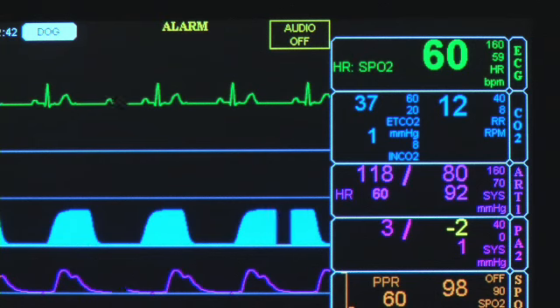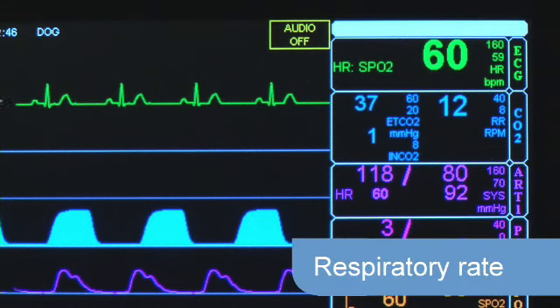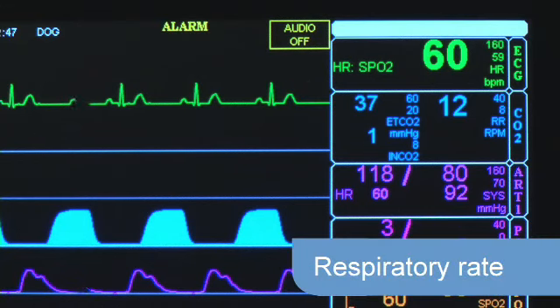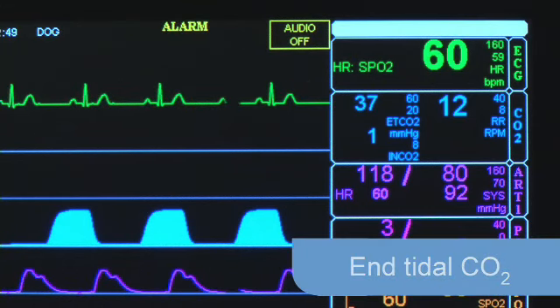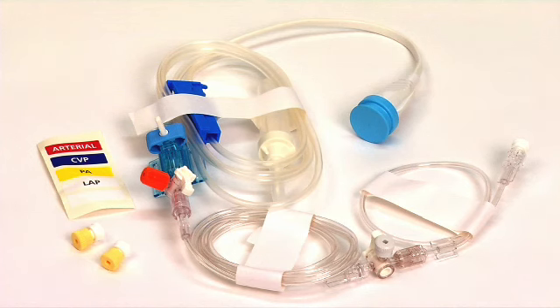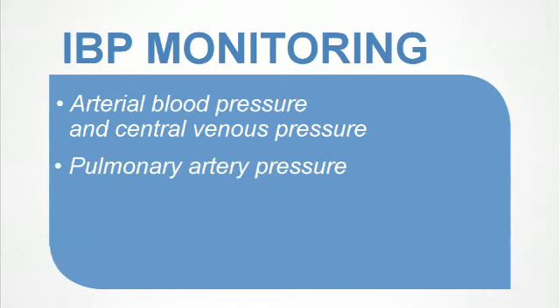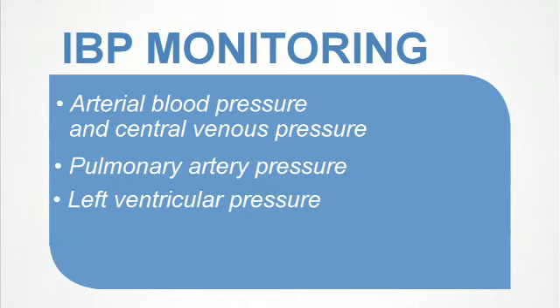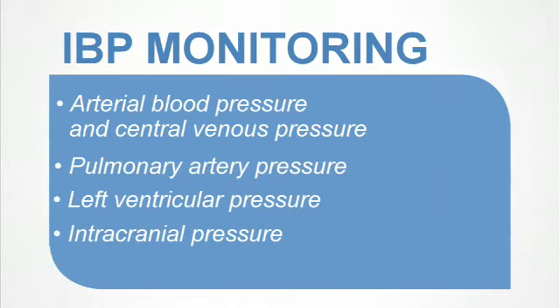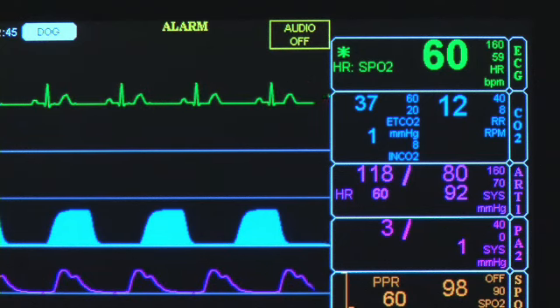You can also observe the capnography waveform on the display and monitor the respiratory rate, end-tidal CO2, and inspired CO2. Optional invasive blood pressure monitoring includes two invasive pressure channels for measuring direct arterial pressure, central venous pressure, and various other hemodynamic parameters. This parameter also features a waveform display.